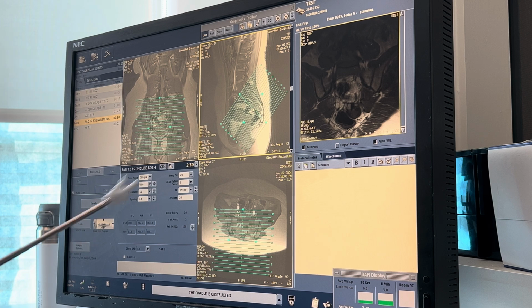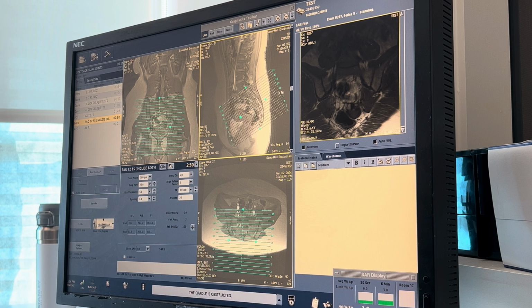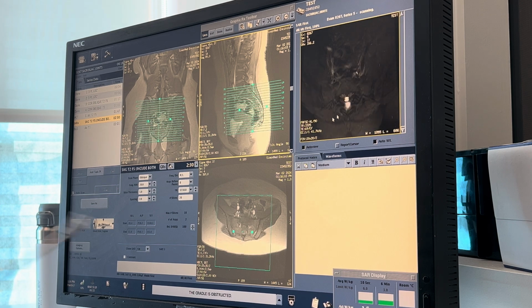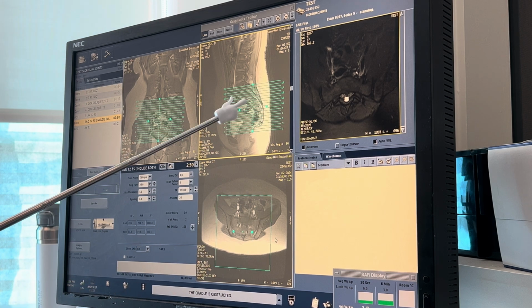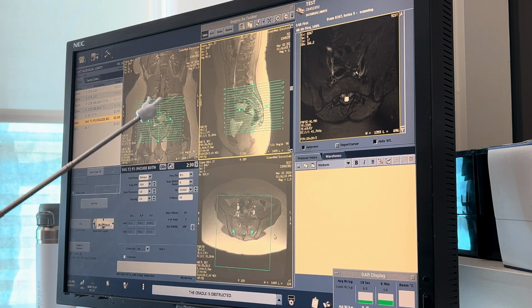And it's trying to plan an axial oblique again. We don't want that. I want you to unoblique these slices whichever way you want. Okay, go that way. So now we have the FOV in the axial plane, but that means that the slices are angled facing superior and inferior. So we want to turn these facing left and right.